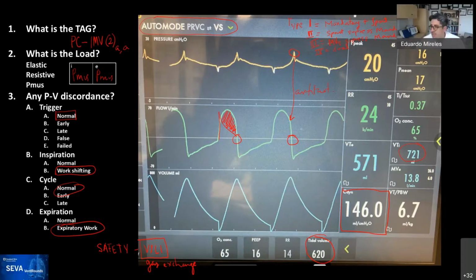No, I guess the question was why would we let him breathe spontaneously at higher PEEPs? Probably that's the question. I don't know. Our team, if you want to clarify there, that would be useful. I will ask: at a high PEEP level in patients with very high respiratory drive, would that achieve the goals of preventing ventilator-induced lung injury?